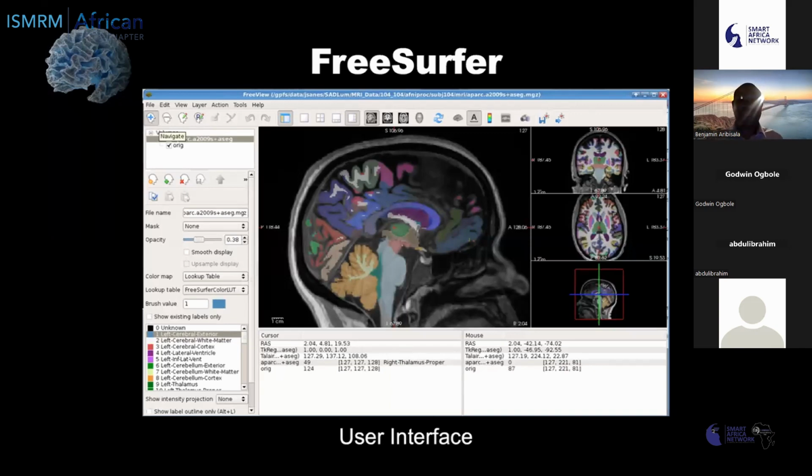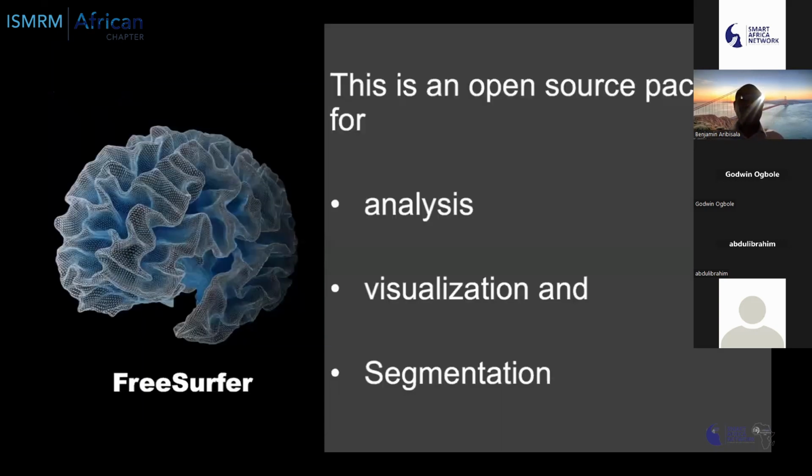I've used it a lot, and it's particularly good when you want to extract the cortex, and it comes with its own visualization tool, which I have found very, very useful. Just like others, it's open source. You can use it for segmentation. Now I'm aware that, a long time ago, FreeSurfer and FSL collaborated, Oxford University and Harvard. So FreeSurfer and FSL can work together. You can do part of your processing in FreeSurfer and then go to FSL, or the converse.